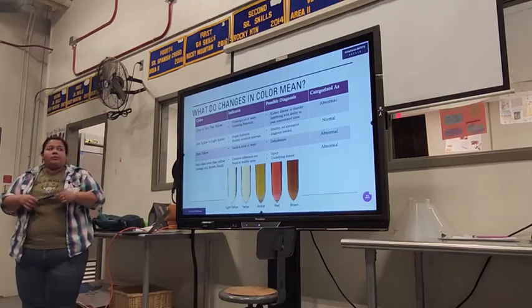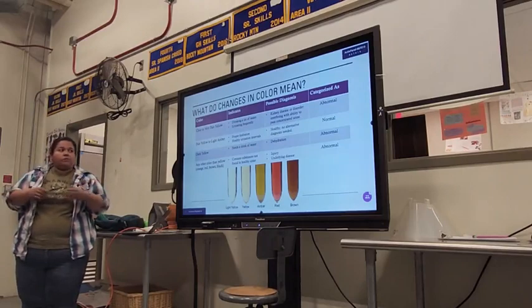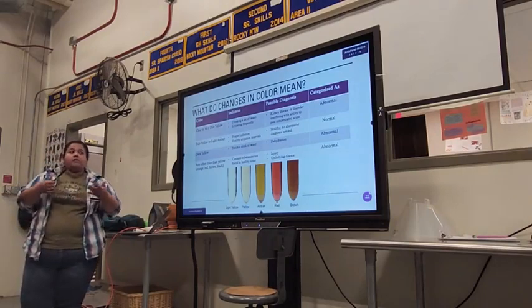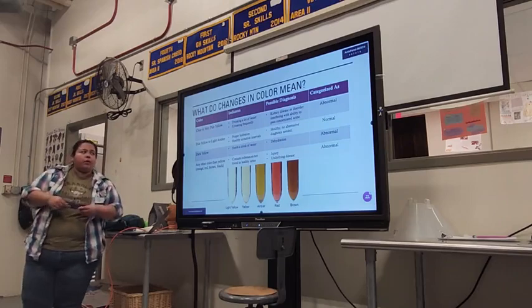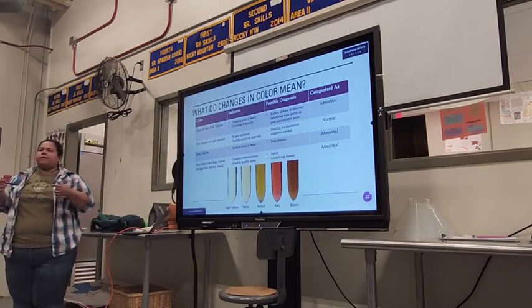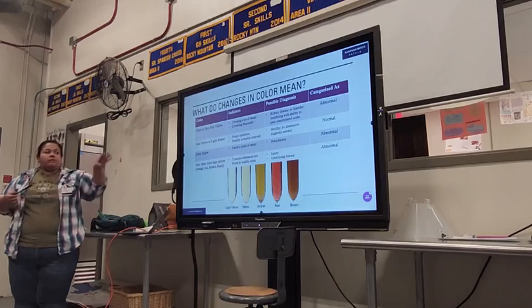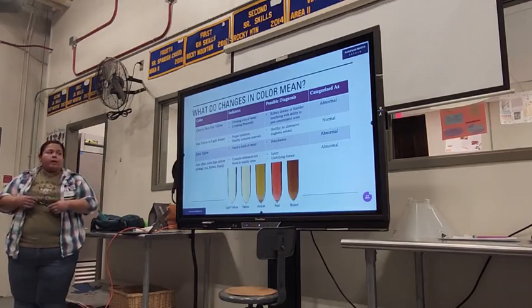What is the probable diagnosis? Nothing. They should be healthy with these two colors, right? This is normal, right? That's its category. Let's look at dark yellow. Definitely need to drink water, because the dark yellow signifies dehydration, right? This is an abnormal reading, okay?